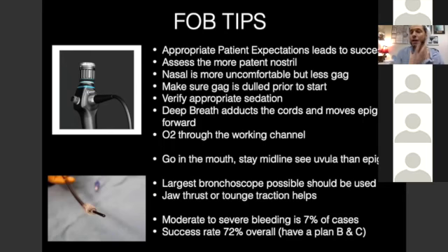We're going to make everything numb like a dentist would numb your teeth. We're going to numb everything, and we're going to put this tube in with you a little bit awake to keep you safe. If they understand that, it's going to be a lot less of, what are you doing? Pull the scope out. What are you doing? Now they shouldn't be awake enough to do that, but patient expectations lead to success.